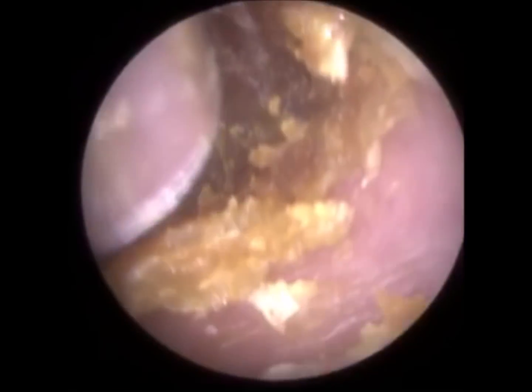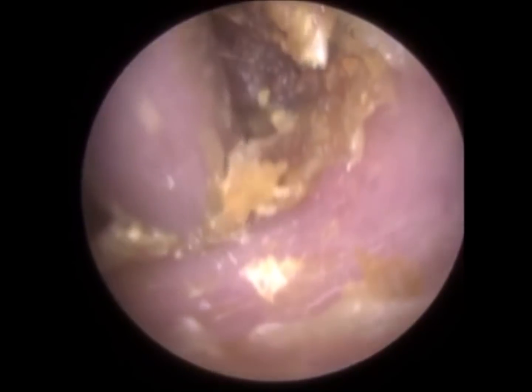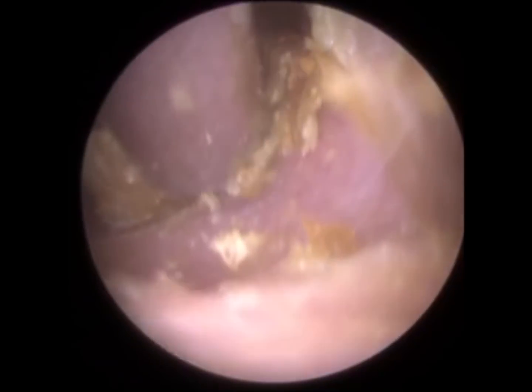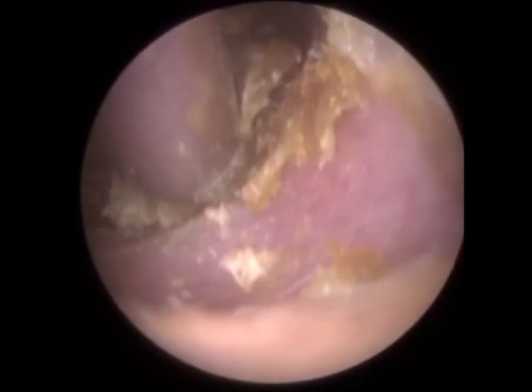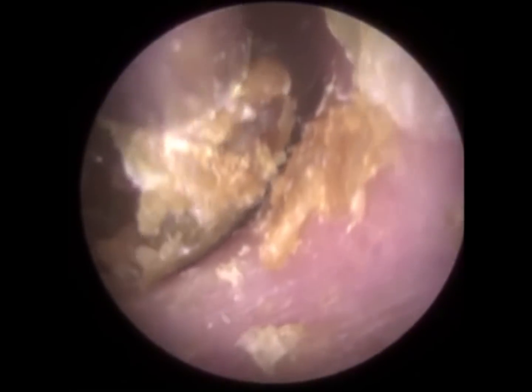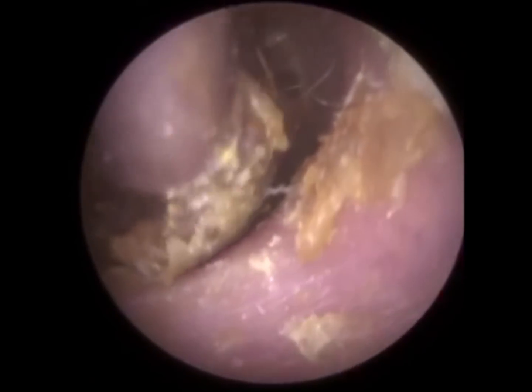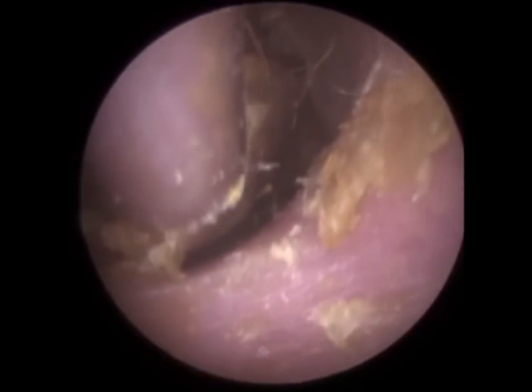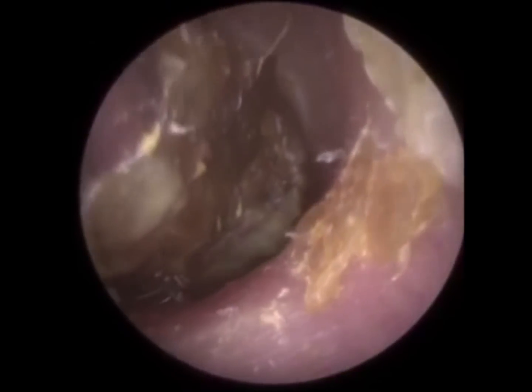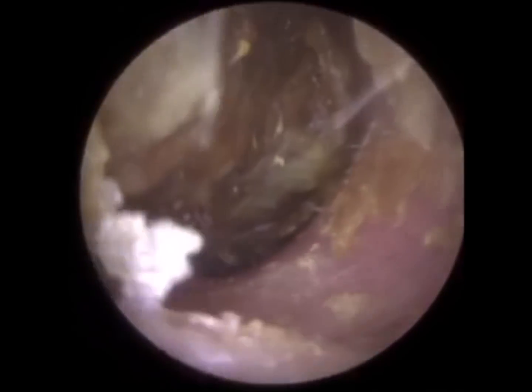If you're working on the outer part of the ear, it's fine because, as I said, you can make contact with the canal wall. But if the wax is quite medial, which it was in the right ear, Jobson horn ear hook wasn't really the best choice of instrument. Sometimes we have no choice. The suction probe doesn't help, so we just have to evaluate each case as it comes, the risks in each case, and where it's needed, we just use it.